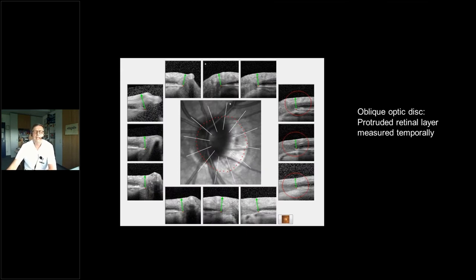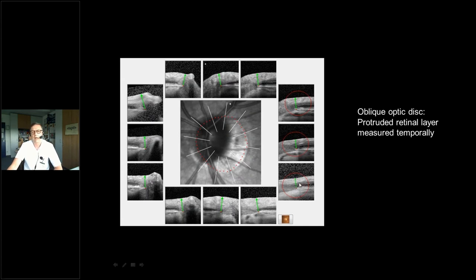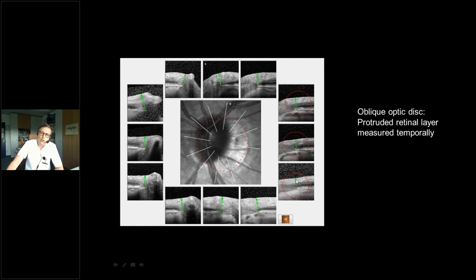In a very oblique disc, the Bruch's membrane opening may lie far to the temporal side. When measuring the shortest distance to the internal limiting membrane, not only the rim is measured but also protruding retinal layers — in glaucoma we wouldn't expect change in those layers, but this may lead to artifacts in follow-up examinations.